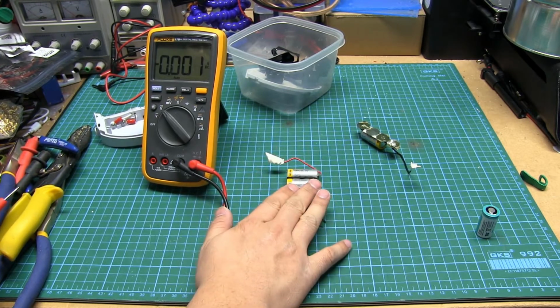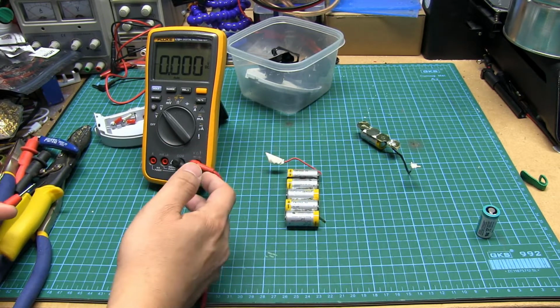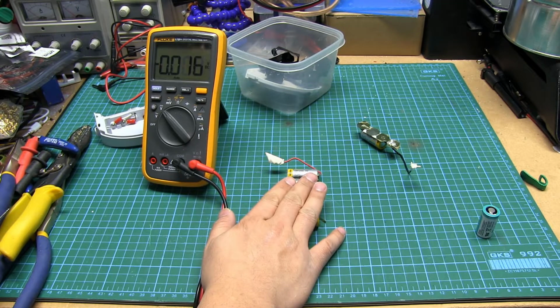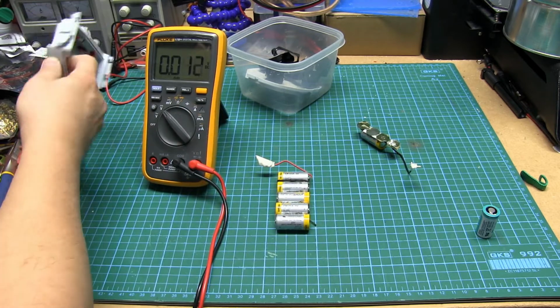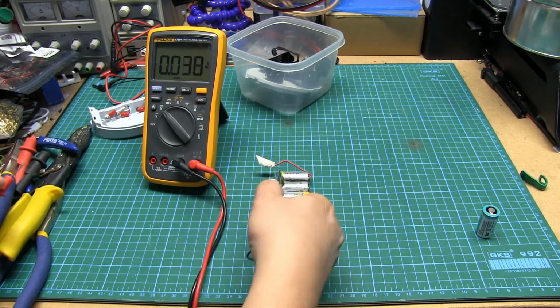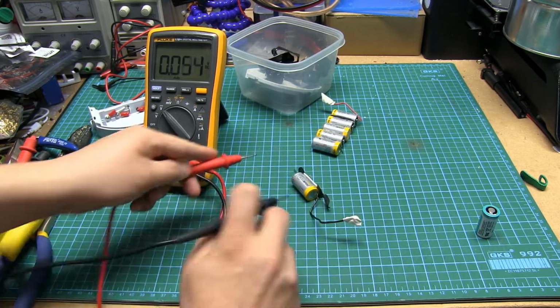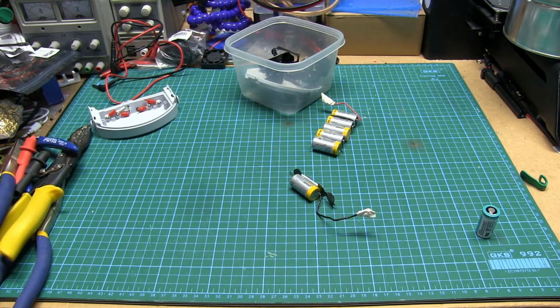I did charge up the capacitor in the AED quite a few times, but I suspect that they build this with quite a contingency because they say replace that after 1 use, mainly because the pads have been opened up and they're exposed to the environment, bacteria, everything else. Oh, let's not forget to measure this guy as well. 3.114. Those batteries probably still have a good life in them. I'm going to probably rip the battery tabs off and put them to a second life inside some flashlights.